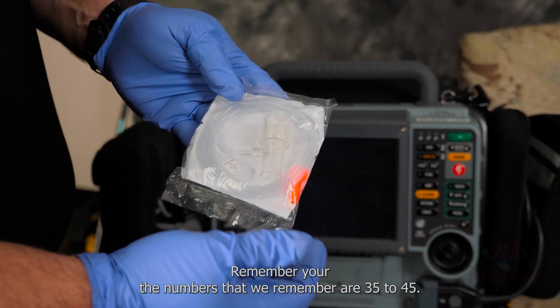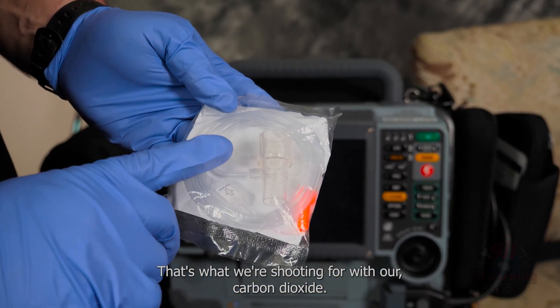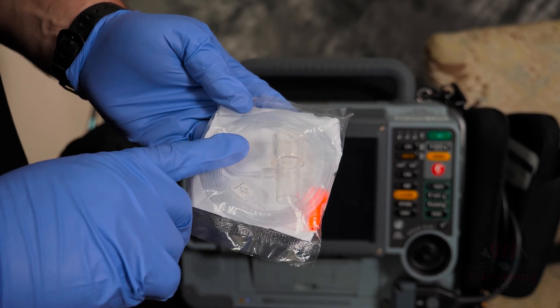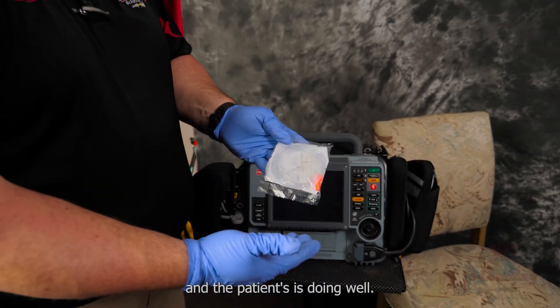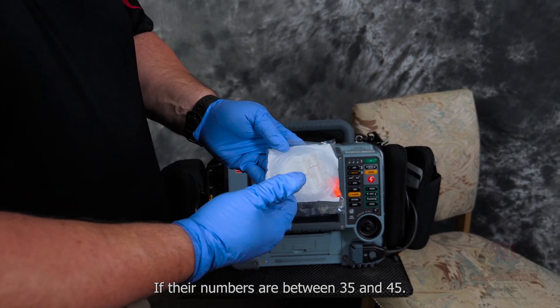The numbers we want to remember are 35 to 45 — that's what we're shooting for with our carbon dioxide. That lets us know we're in the right place and the patient is doing well if the numbers are between 35 and 45.